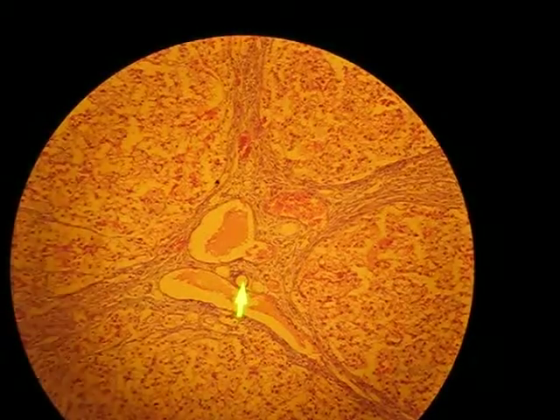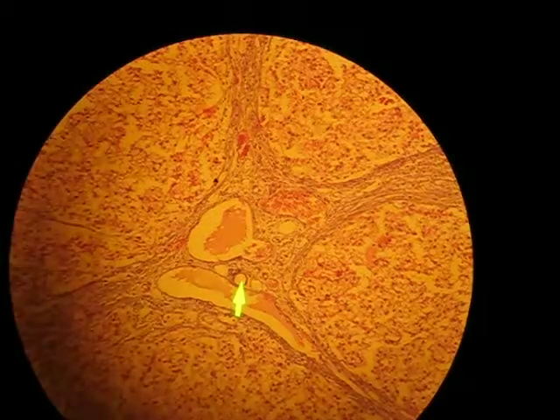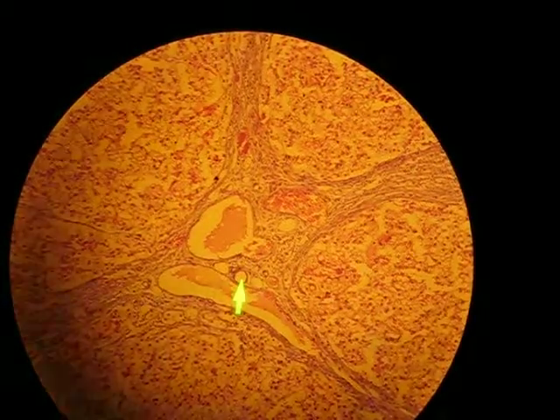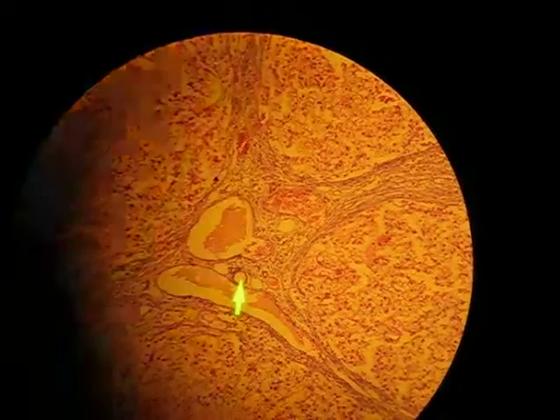I'm gonna go with this one here as the artery. You have to get it just right, because it has a little bit of a wall. Yeah, right? I can see that. Okay, so you get the artery. So now we have to find lymphatics, a little tougher.